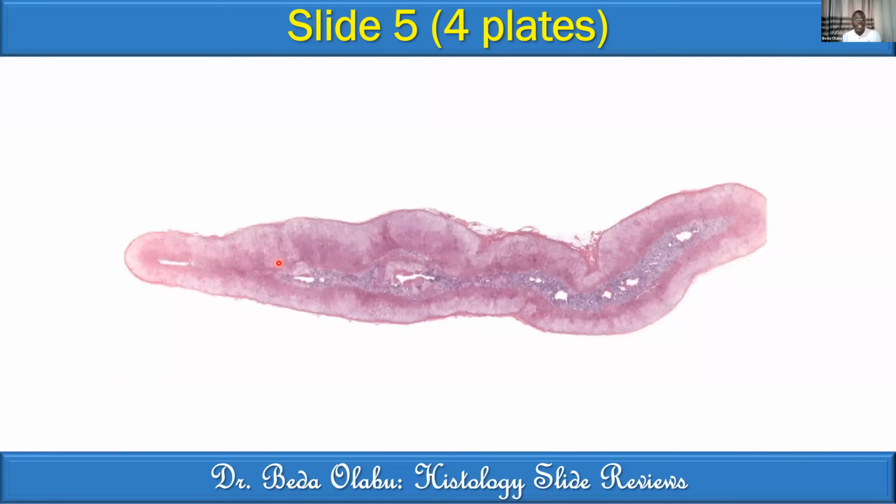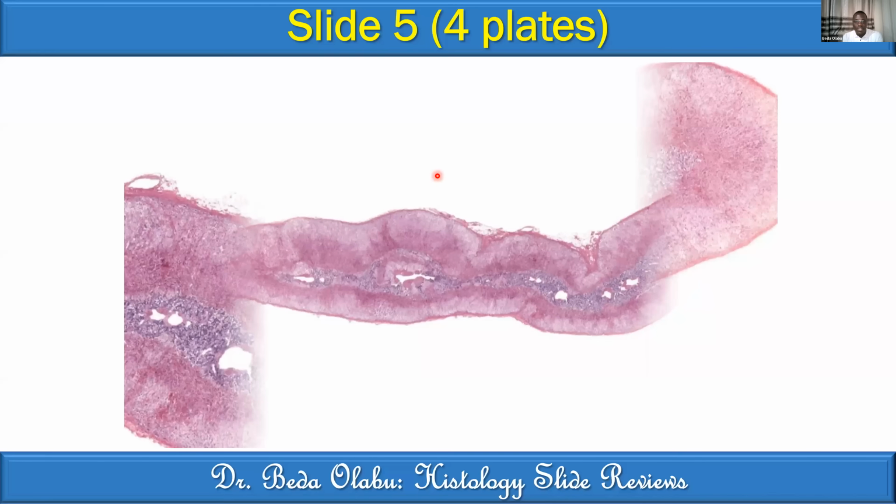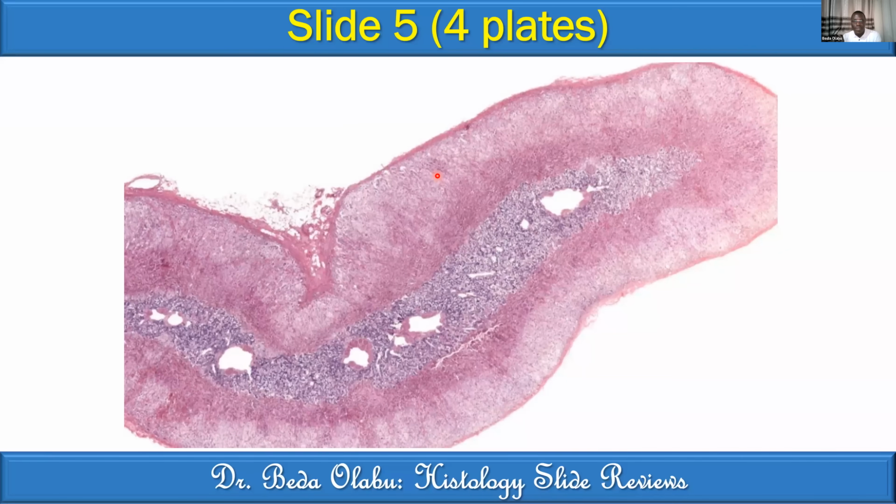Okay, fifth slide. So this is the lowest magnification. Capture something. I have four magnifications for this one, but I'll show you three of them to start with.